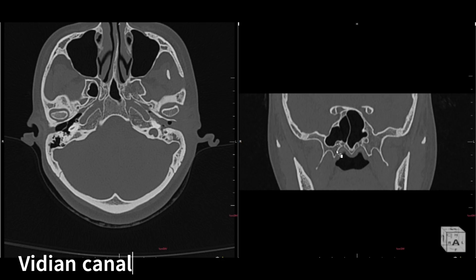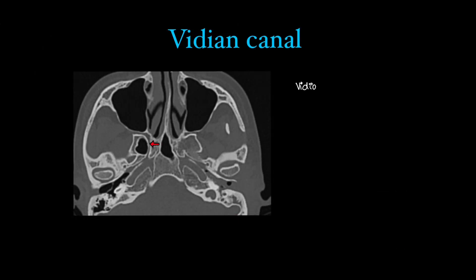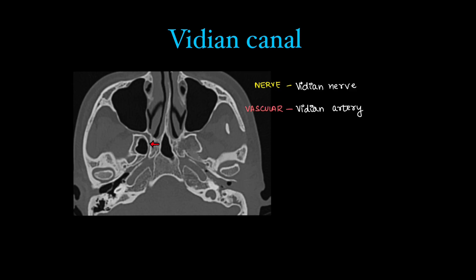Locate the pterygoid plates — above them you will have the vidian canal, which also joins the pterygopalatine fossa. Another way to remember it: you can see the carotid canal here, where the carotid artery gives off a vidian artery branch, so you can always see the vidian canal connecting to the carotid canal. Structures running through it are the vidian nerve and vidian artery, which is a branch of the internal carotid artery.